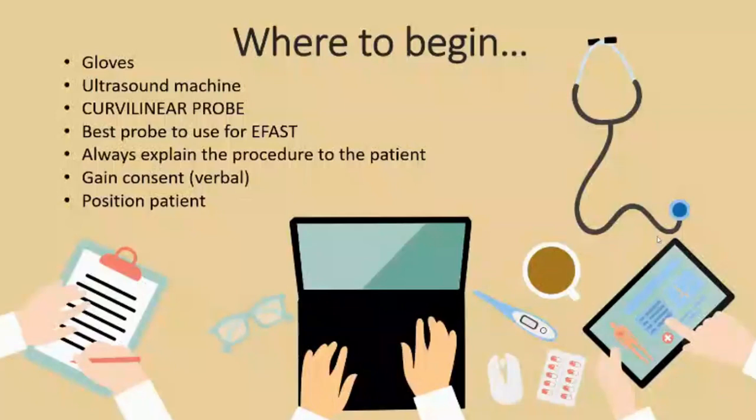The other thing that's quite important is also to explain the results to the patient. Often we just do the ultrasound, move on and document our findings, but it's important to tell the patient what you are looking for and what you find, because patients are often very stressed and worried in these settings.